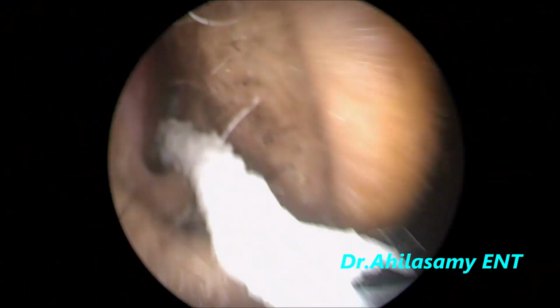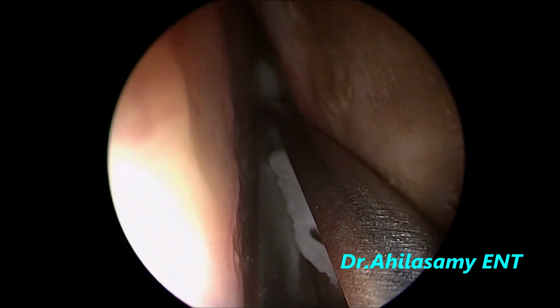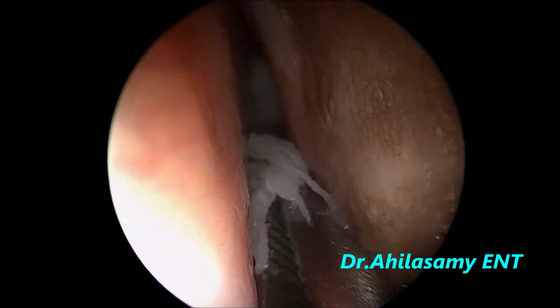As usual, the first step is packing the nasal cavity with a roller gauze soaked in 4% lignocaine and adrenaline in the ratio of 1:1 repeatedly.